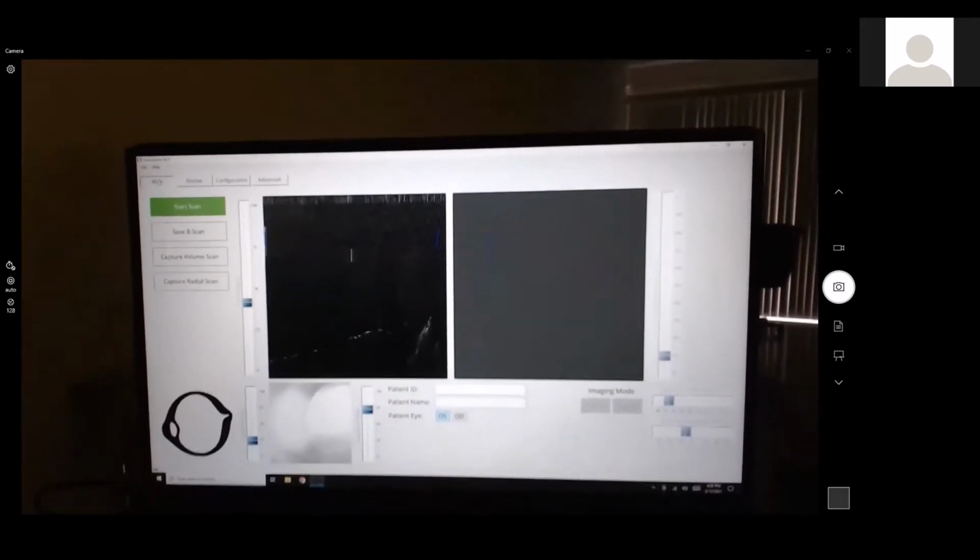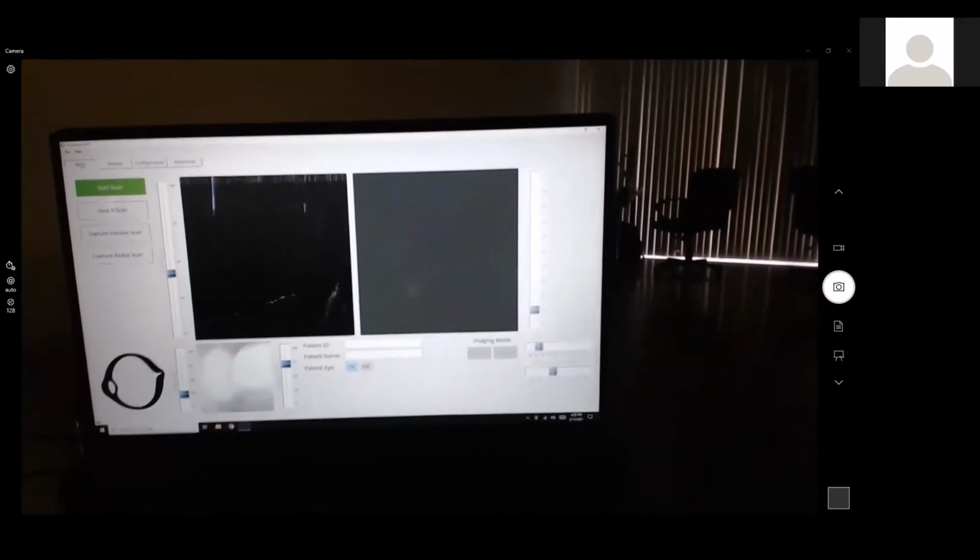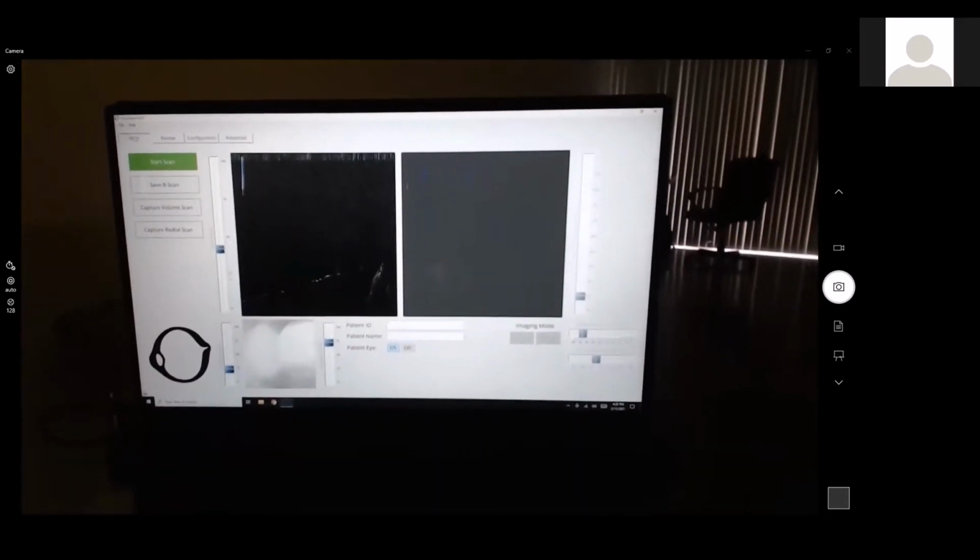Okay, so let's move on to, I haven't checked for questions here or anything as to what we're doing. If there's no other questions on the cornea or anterior side, we'll go over to retina. Okay, so let's go ahead.